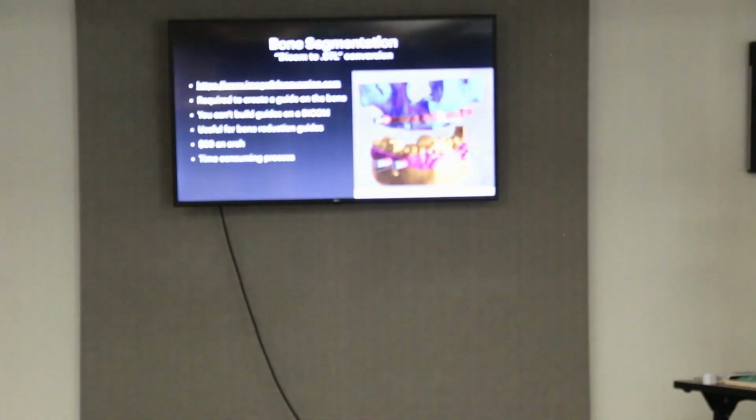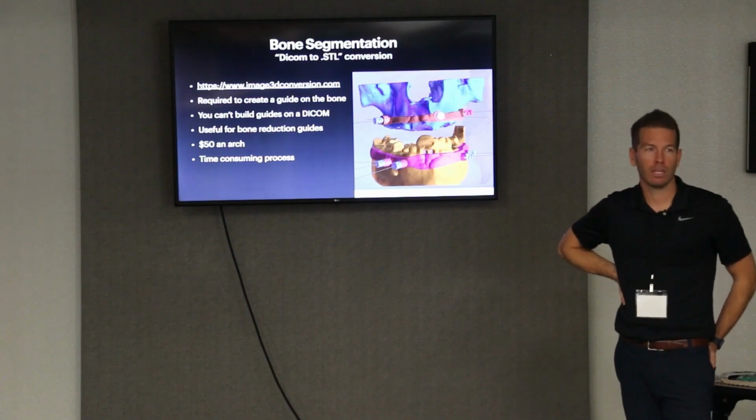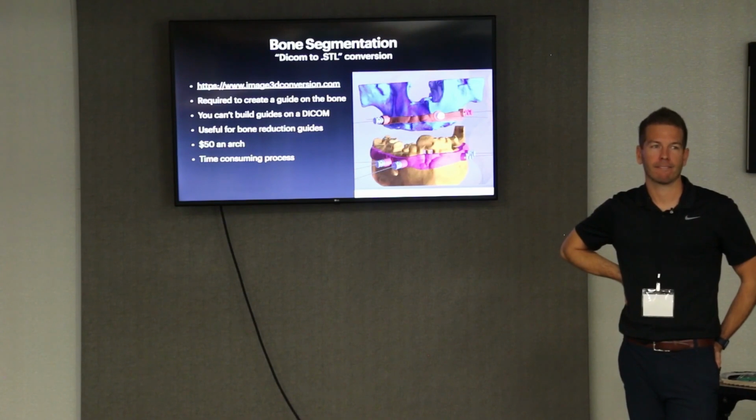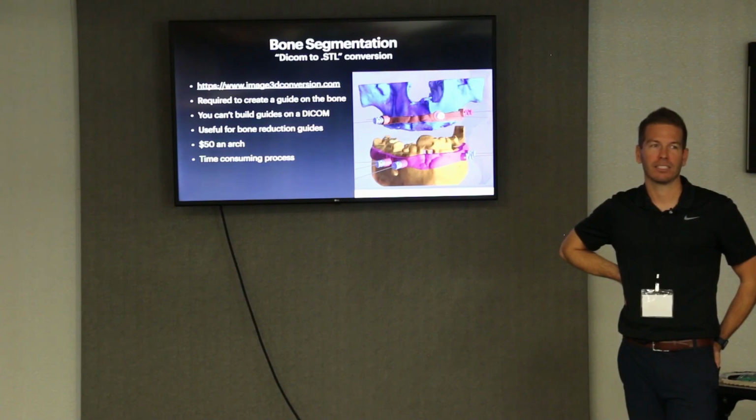Yeah, so Matt, on the soft tissue guides, I'm 0 for 3 since our last meeting. Like, you printed them? I did the denture, and every time I go in, I always slip to the buccal. So I'll just lift my flap and freehand there.